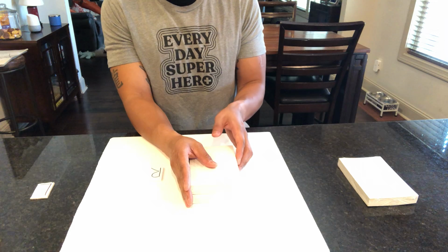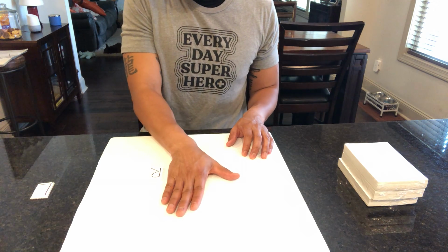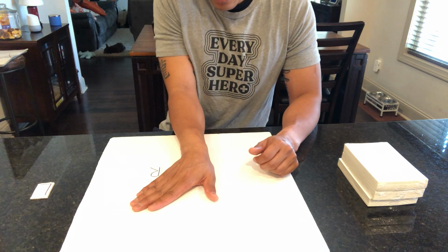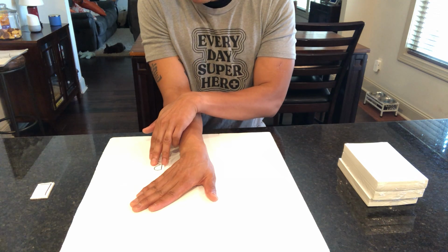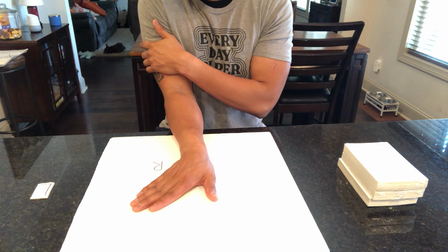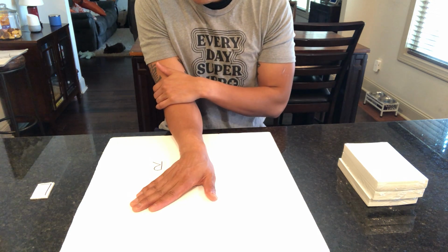We're going to move on to an oblique thumb. So with the oblique thumb, we're looking at the central ray being perpendicular to the MCP joint of the thumb. Now here, you're at a 45-degree angle.